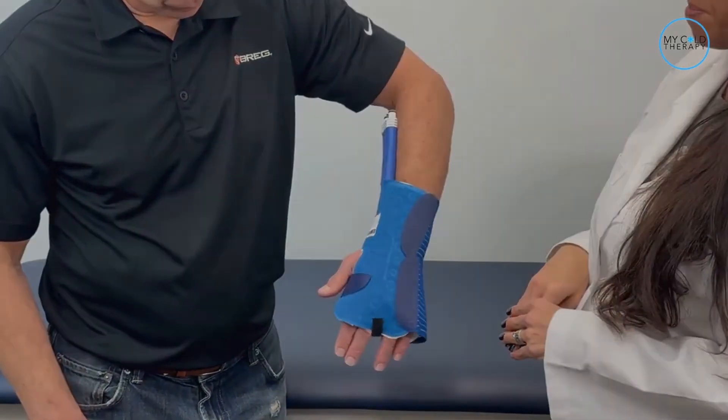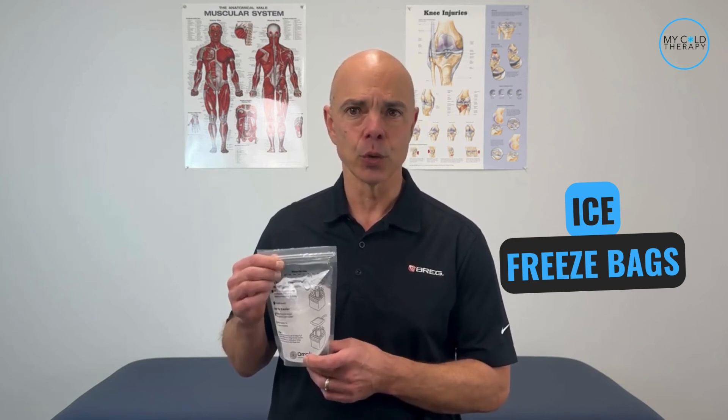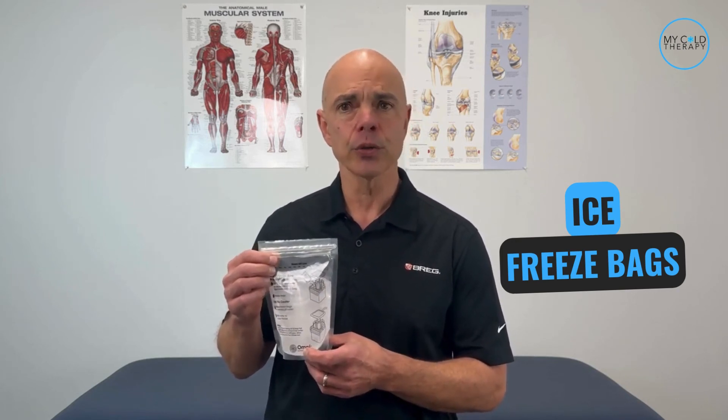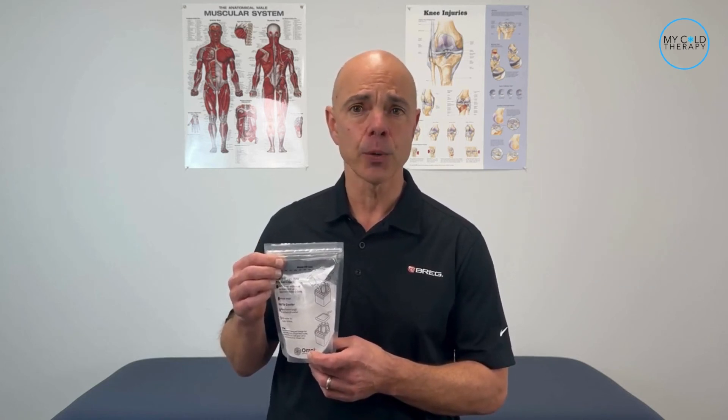And this is what it should look like. Great job, Michelle, in showing us how to do that. As I mentioned earlier in the video, I'm going to show you our number one trick to help make things easier for you. We have freeze bags that you can use in the cooler and they come in packs of 12. You place three in the cooler and the rest in the fridge and then you just keep rotating the bags.